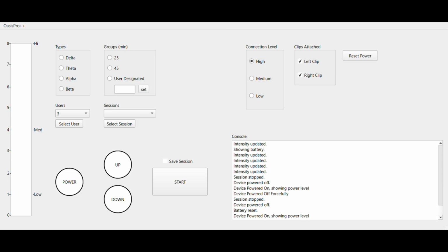But yeah, that's the bulk of the functionality. There's little fringe edge cases too, which are covered. Feel free, you can check out the GitHub and test it for yourself.